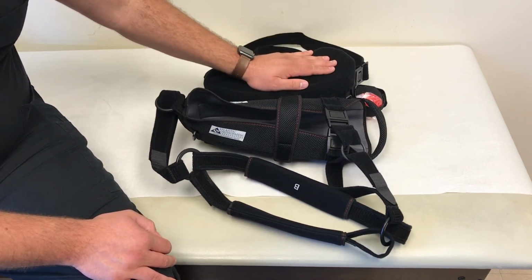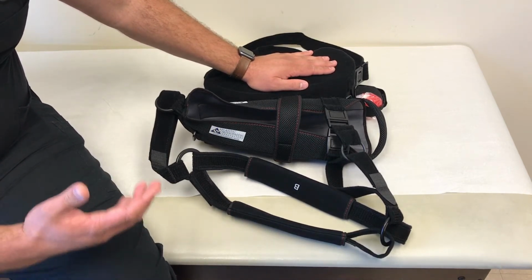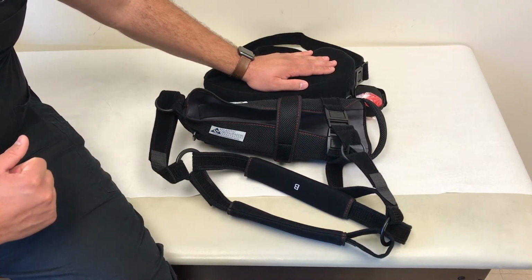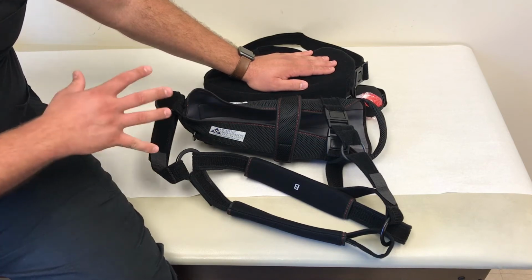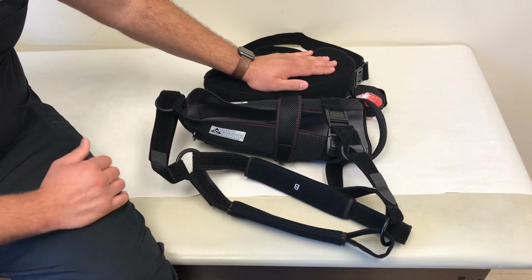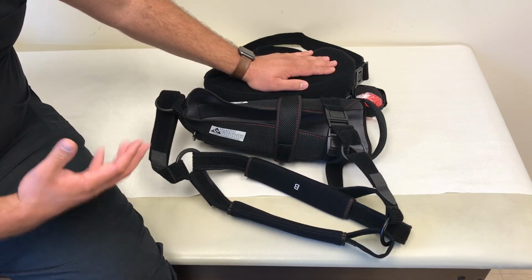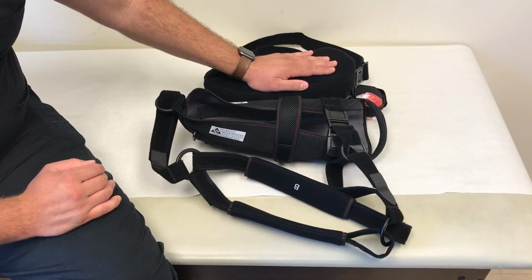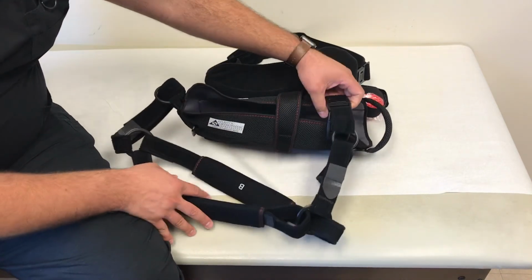The reason why we have rotator cuff patients in an abduction pillow is that it keeps you in about 20 to 30 degrees abduction, which is where your elbow is moving away from your body, from your side. And research studies show that when you're in 20 to 30 degrees of abduction, you actually help increase blood flow to the rotator cuff compared to having it just hang down to your side. And obviously, if you had surgery, you want as much blood flow to the area as possible to help your healing process. So next, I'd just like to show you how everything works.